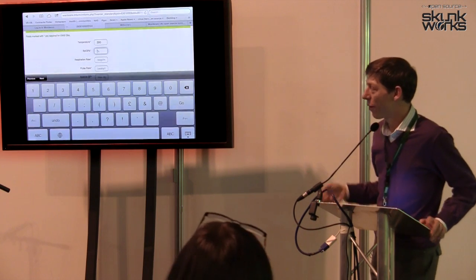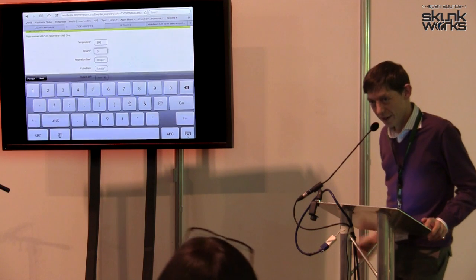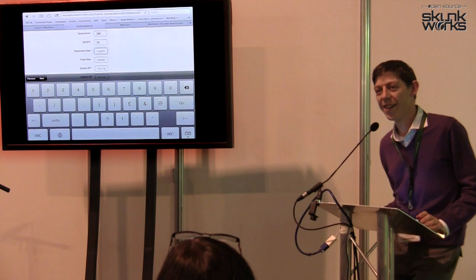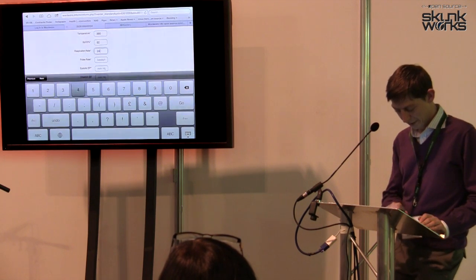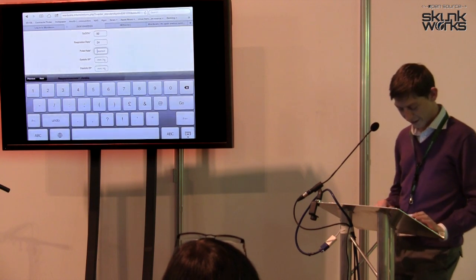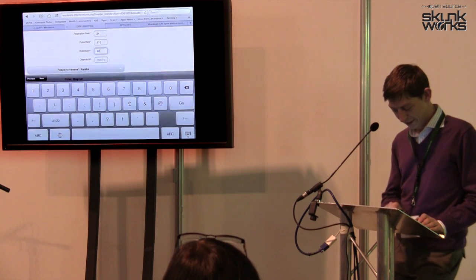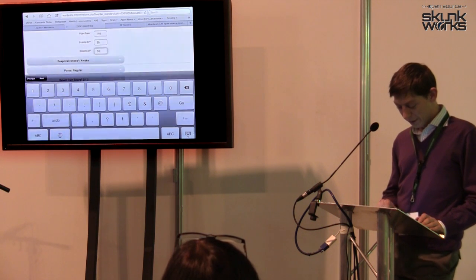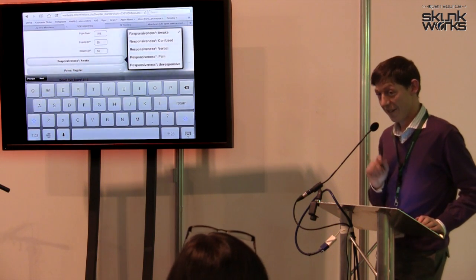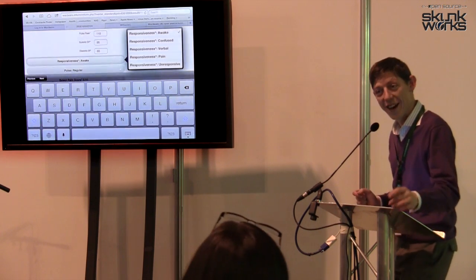But no, it's a good point. Oxygenation. Respirate. Pulse, 110. 95. In a moment we'll get to the oxygen obs and maybe some fluid balance as well. We could do a bit of that.